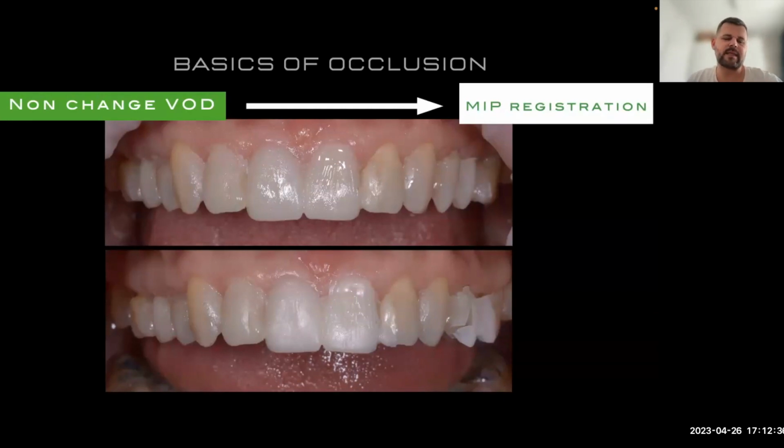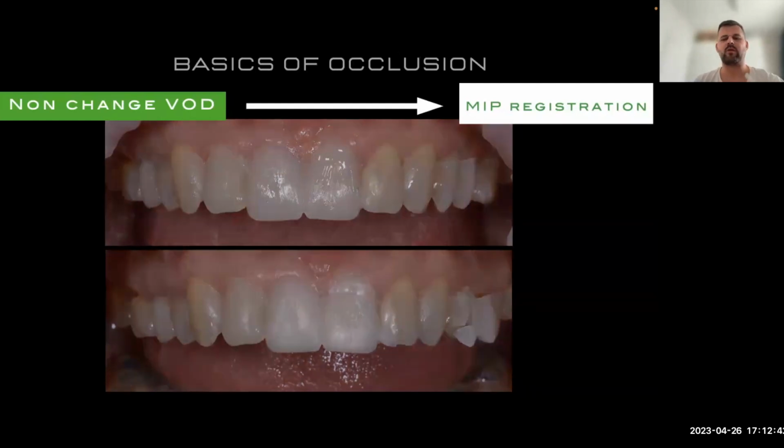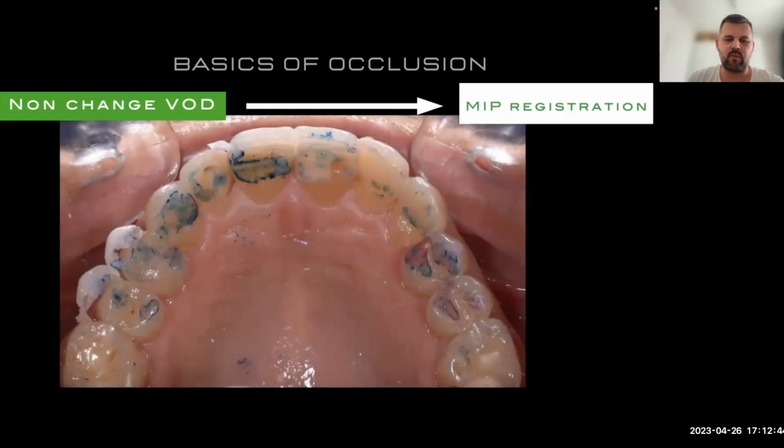If you have that kind of problem right now, you will also have this problem in the future, because when we look at this, we will see a lot of mess. The contacts between the teeth are everywhere. There's no guidance, nothing to protect our restoration.